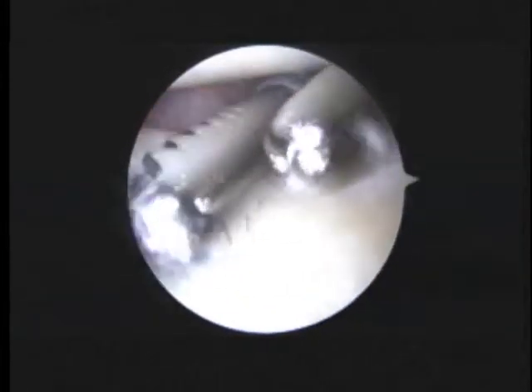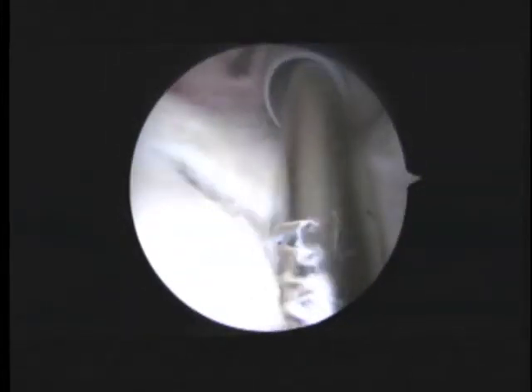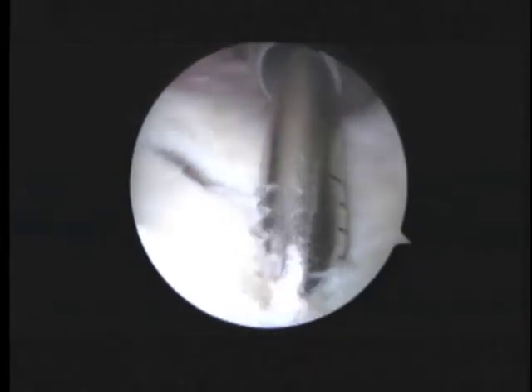We're going to put a double-loaded anchor down here. We're going to take away some of the cartilage here in preparation for reconstructing this.